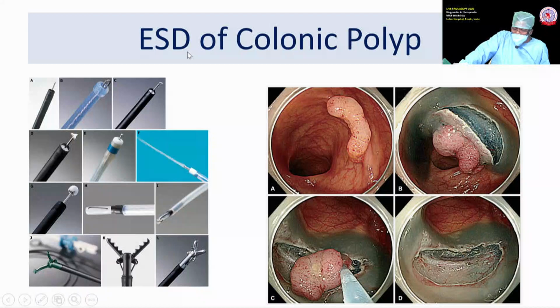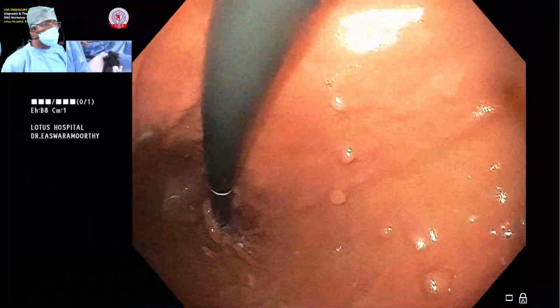It is like surgical dissection, removing a cyst, like a sebaceous cyst, something like that. You have to go layer by layer like this. You can completely remove thanks to the magnification and we are using a cap and special gadgets like all these IT knives and things like that. See, you can see the panoramic view.